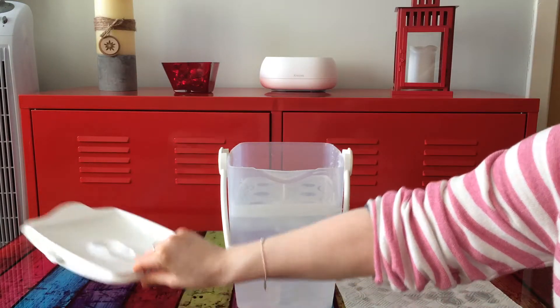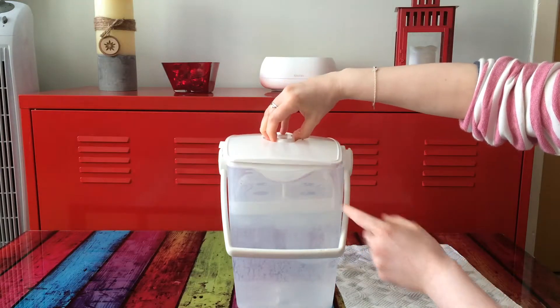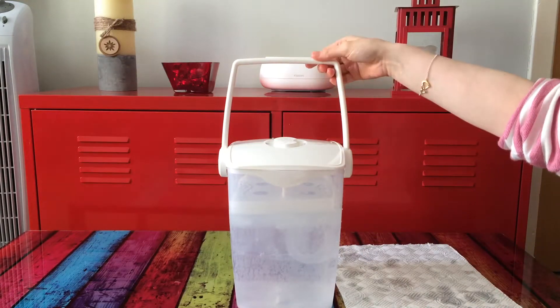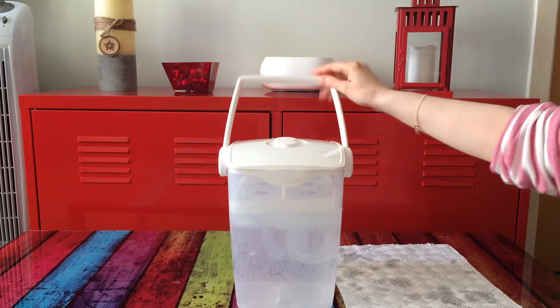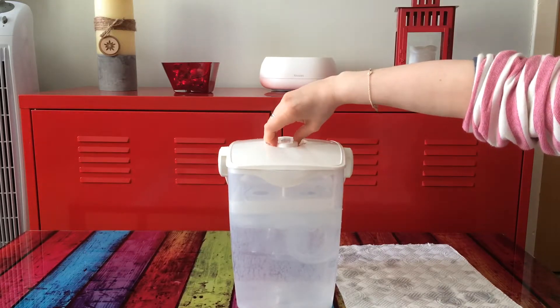You put the shelf on top of it, and then you can put the lid on. When you transport it, you can put the lid up and use the handle on top — and in that position the lid is locked.